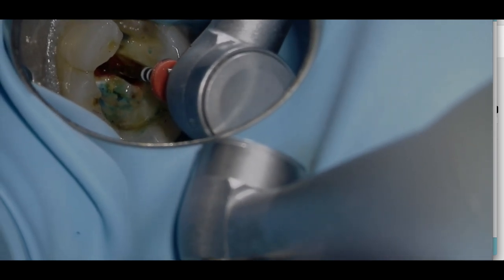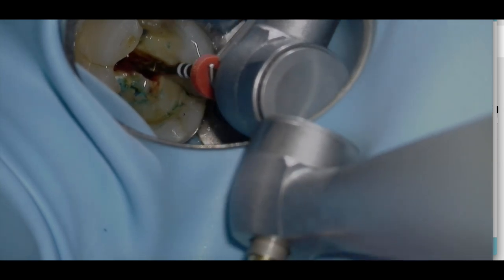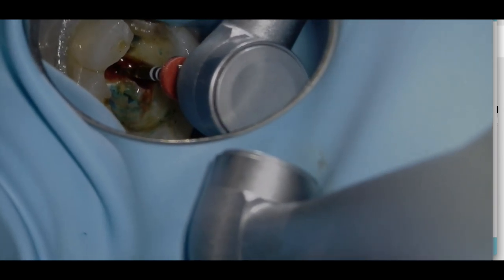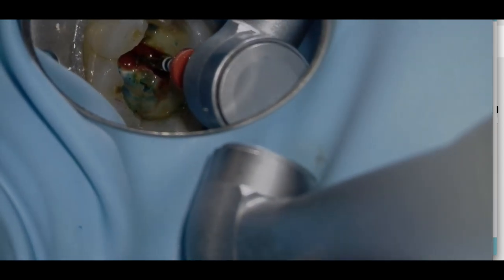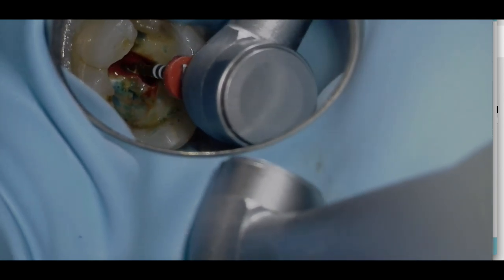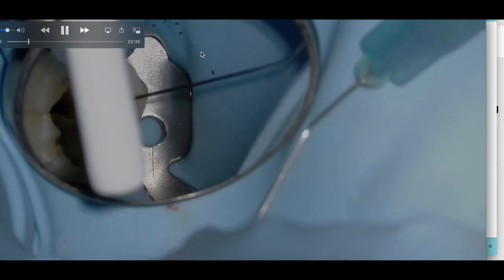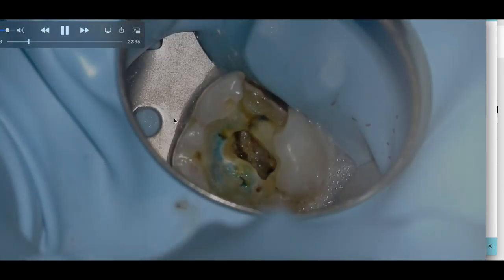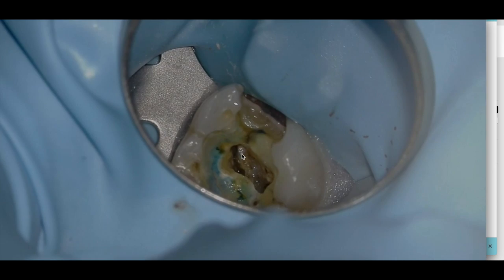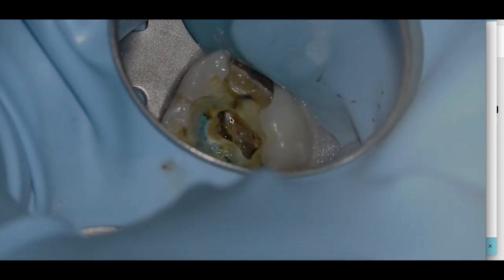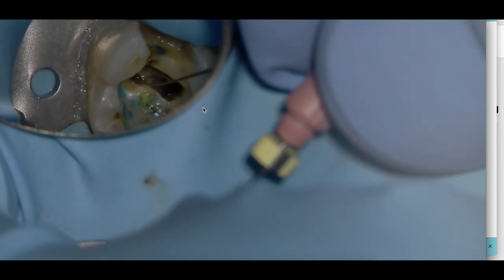What I've found after doing this for almost 10 years is it's a really quick way to open up those cases and get some irrigant down there, and then I can tackle my working length. It's really light brushing technique. I'm actually using the hemorrhage in the pulp chamber to empty the debris in the flutes. What this does as well is it helps to stop any of the hemorrhage. Once I remove the coronal two-thirds of that pulp tissue, all of a sudden the hemorrhage stops and you're not battling to get your files in there. Even if you use an SX and open up the orifice, that pulp is irritated and just continues to hemorrhage.